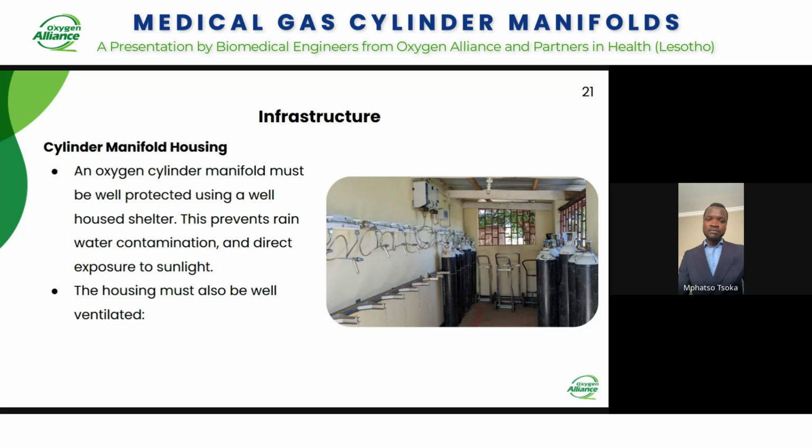So with the coming of the manifold and the pipeline, it has reduced that kind of risk, that instead of giving oxygen, you're giving a different type of gas. Now the terminal outlet is very specific to the type of gas that you need, which is an advantage. And that makes this a very important talk, especially these days when a lot of hospitals are now having these manifolds and also the pipelines. So that's why it's an important discussion to have, especially for those working in the medical field.